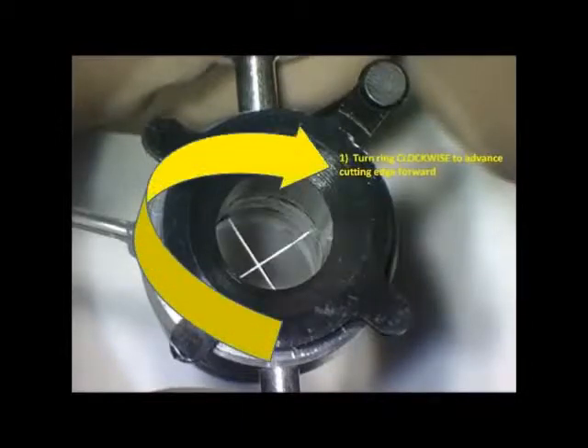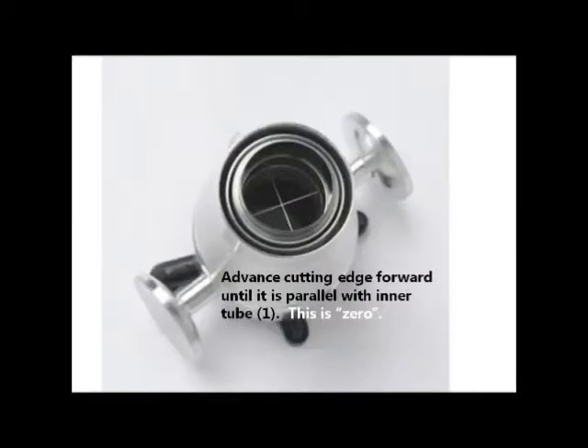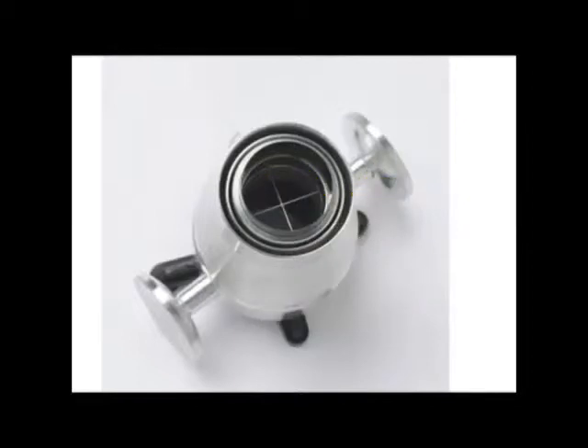To zero, look under the microscope and align the cutting edge with the inner tube by dialing clockwise. Zero is reached when the cutting edge is parallel with the inner tube. Note the position of the longest pin, which is the indicator pin.